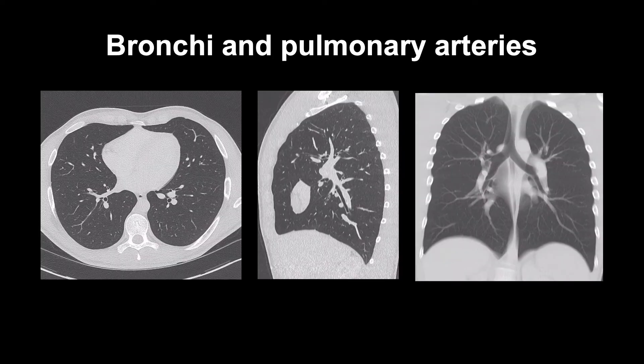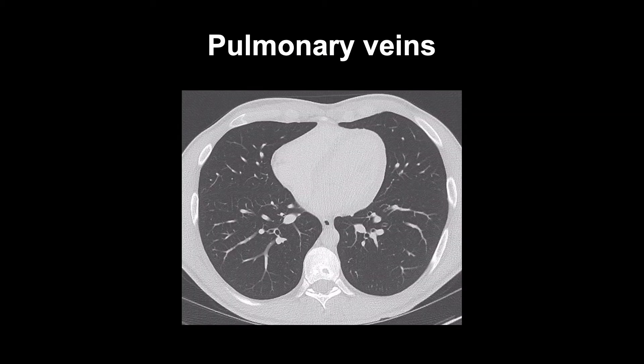Bronchi and pulmonary arteries run together and branch in parallel. Arteries divide into two branches of similar size, each smaller than the parent vessel. The airways and arteries smoothly taper as they move from the center to the periphery. Veins run independently of the arteries and airways, and also taper as they move peripherally. But rather than dividing into just two branches like the arteries, veins have multiple branches, generally at right angles to the parent vessel.